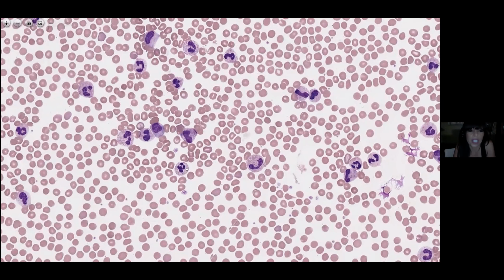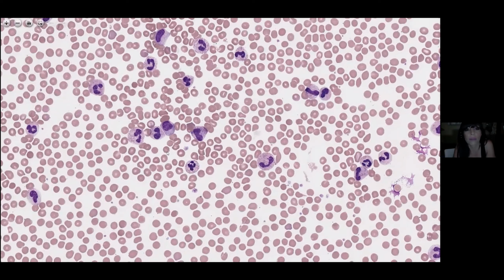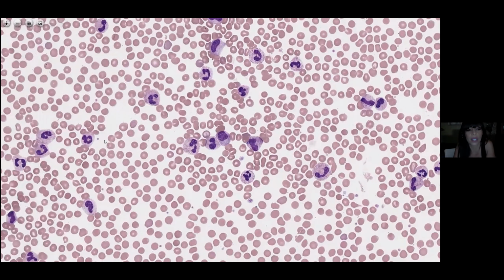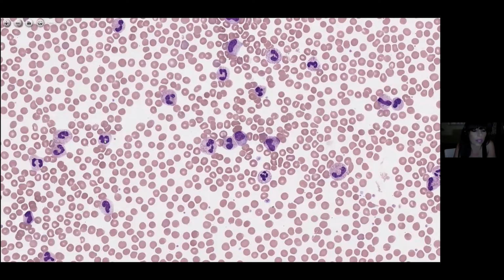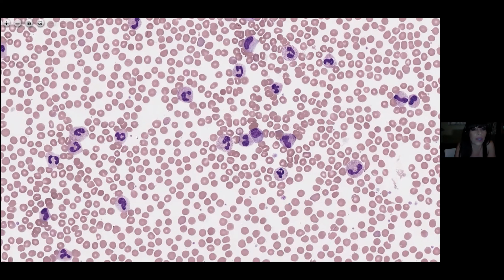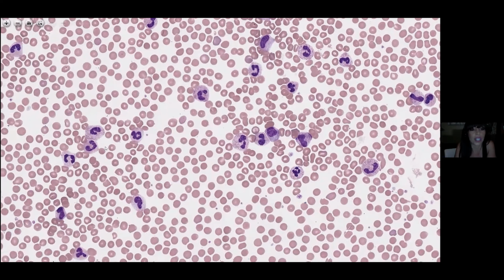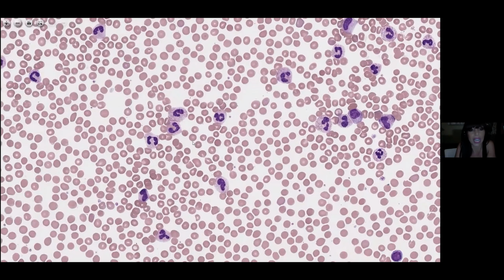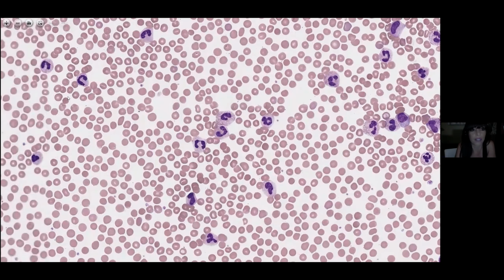Yeah, I was interested to hear that because I've always had to differentiate, and I have noticed when I look at prior results, my results, that there's a lot of variation in what people call a band. So as a clinician that would be confusing if one day it was 25 bands and the next day it was 8 and the day after that it was 25 again.